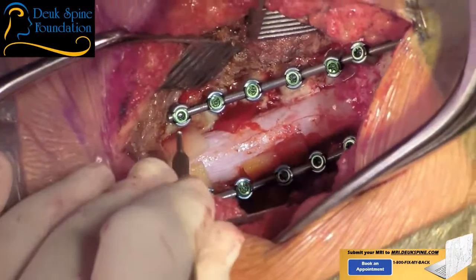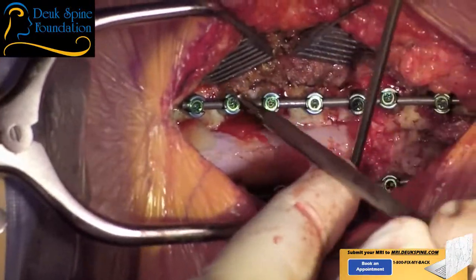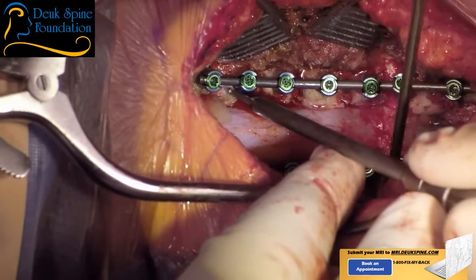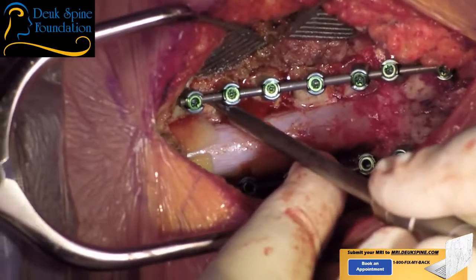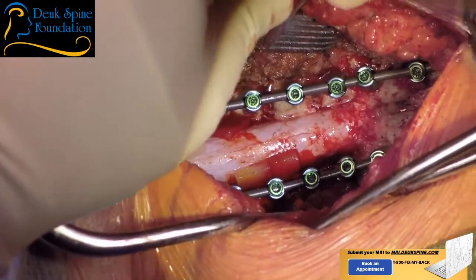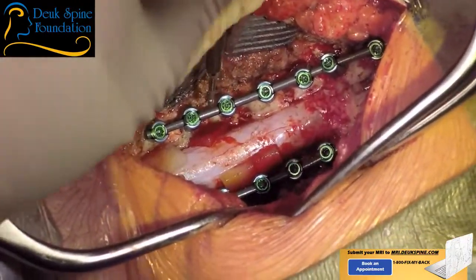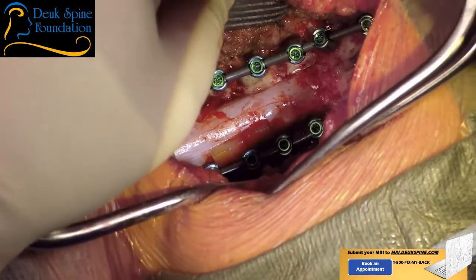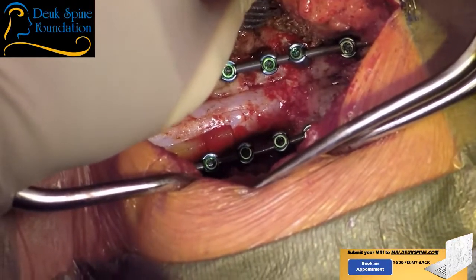So obviously you don't want to hit the spinal cord while you're doing this. It would be really bad. So you got to really pay attention, not just to the tip, but to the shaft. And I'm going to decorticate the lateral masses as well as the inner facet space. And I apologize if my hands get in the way. Suck here? Right here. Now, if you start getting bleeding during this from the bone, you don't want to use bone wax. You want to use gel foam and thrombin. Gel foam and thrombin don't stop fusion.